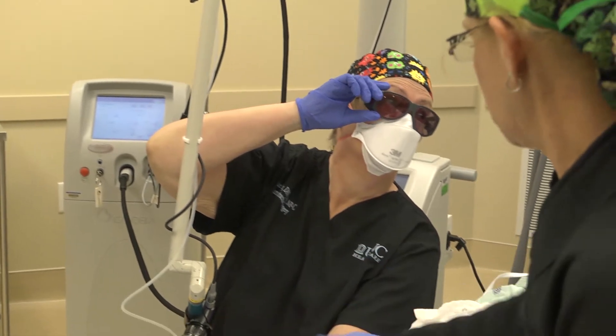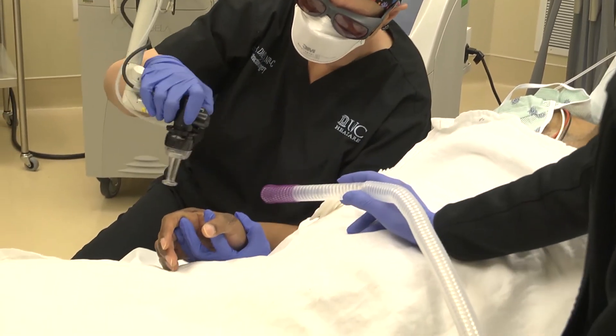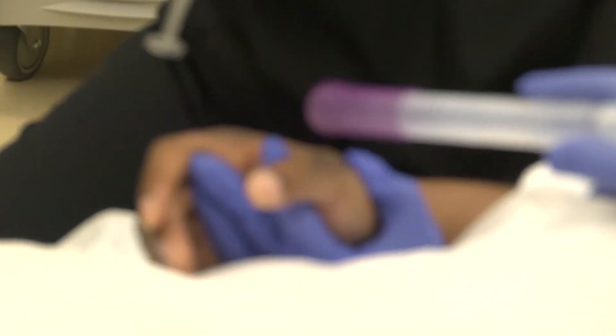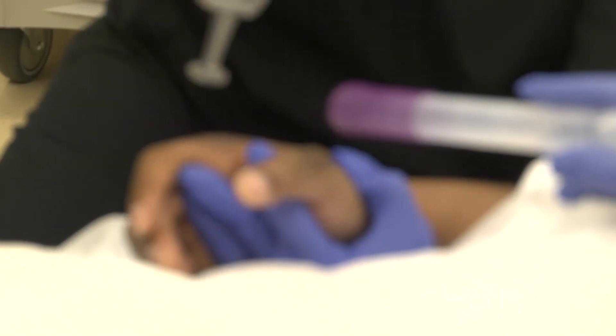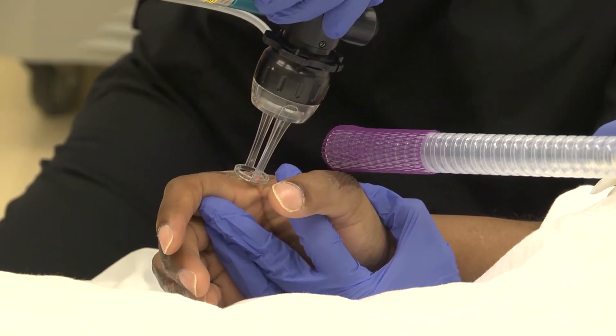We're specifically focusing on his hand. He is a 60-year-old gentleman who had a flame burn. He's had a skin graft, and now he has contractures on his hands and his fingers, both sides, which are mild to moderate.